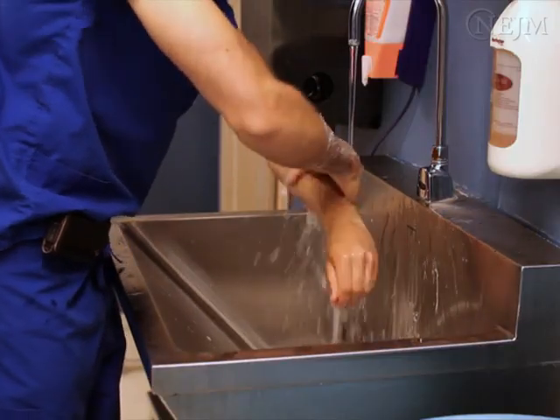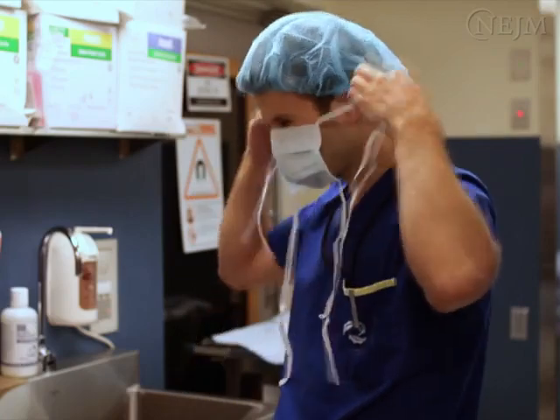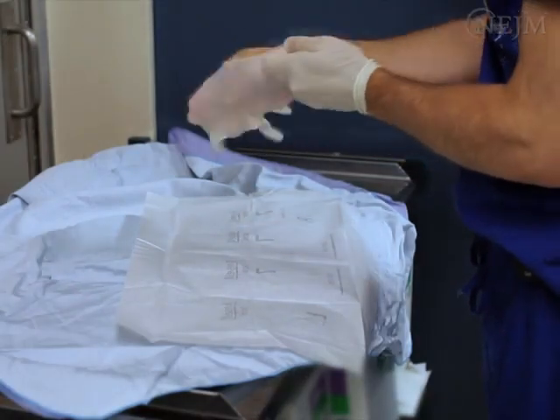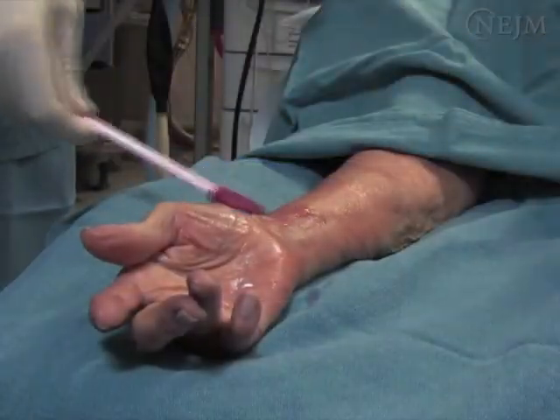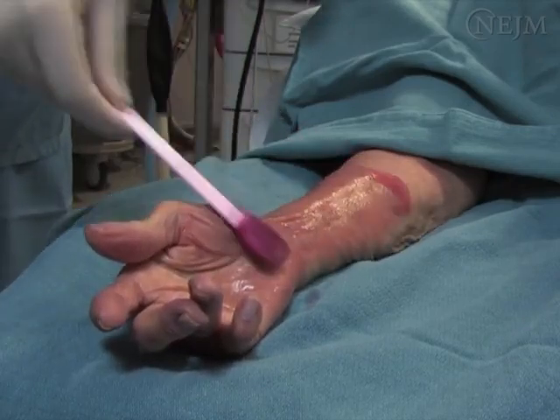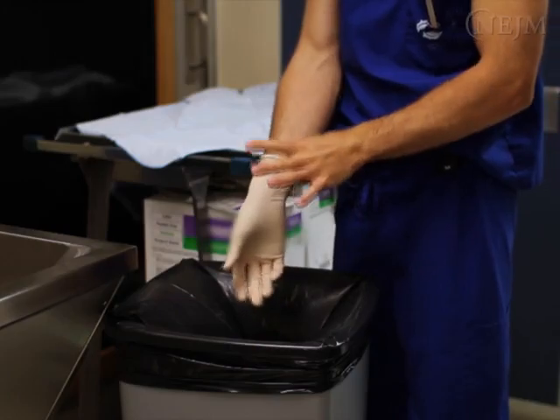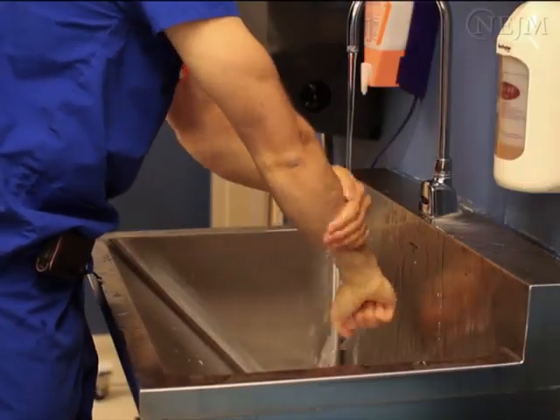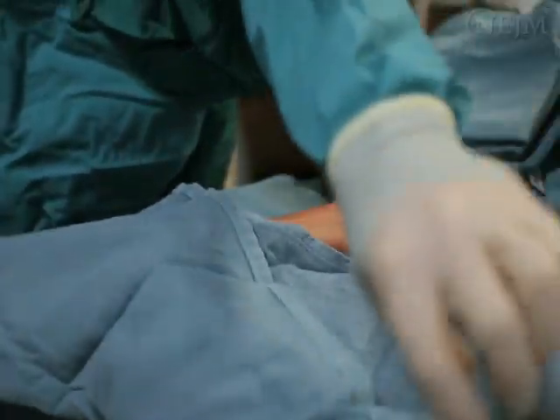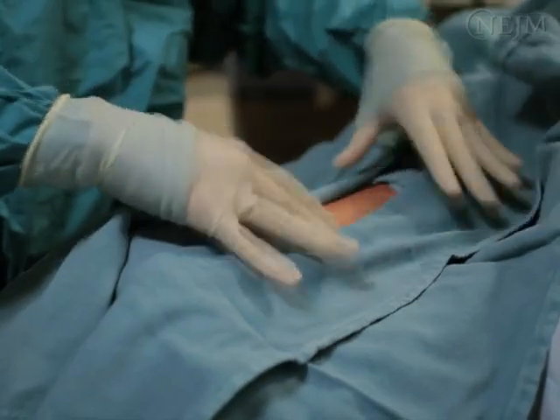Wash your hands before touching the patient and put on the mask. Position the patient's wrist so that the forearm is flat. Put on a pair of sterile gloves and use antiseptic solution to wash the skin of the patient's forearm from the wrist to the antecubital fossa. Discard the gloves, wash your hands again, and put on the gown and a new pair of sterile gloves. Drape the patient, exposing only the cleaned forearm from the wrist to the antecubital fossa.